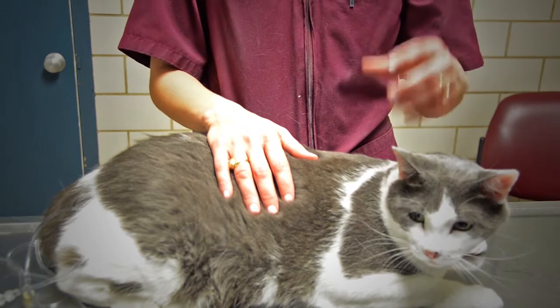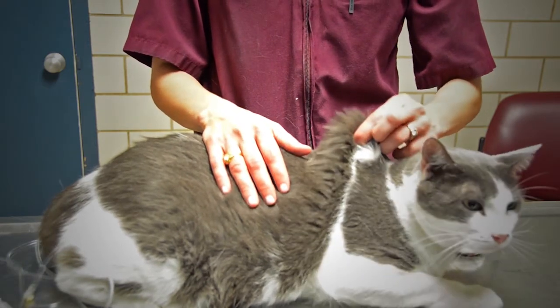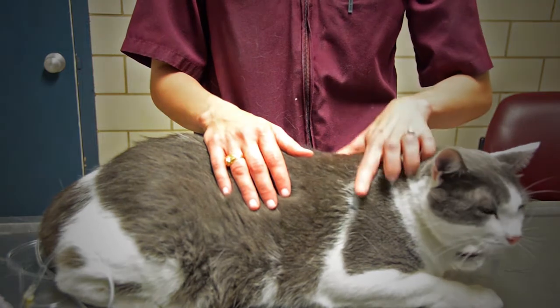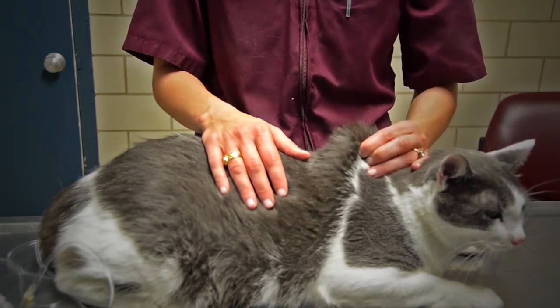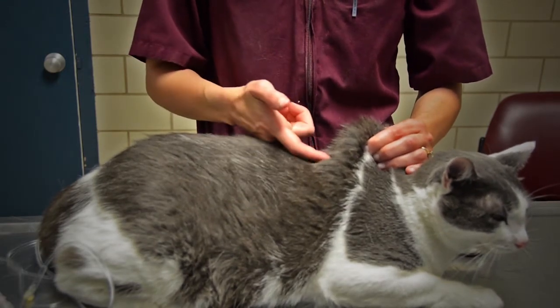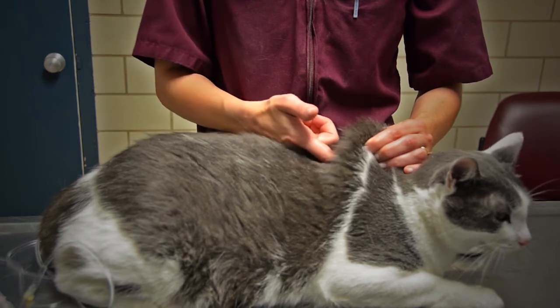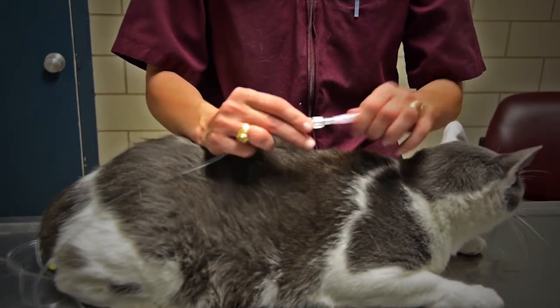You want to use a different area each time, so you don't want one particular area to become overly sore. The next thing you'll do is gently pinch the skin and create a tent. You see my fingers, I'm not getting a huge amount of skin. I'm getting a little bit of skin, and I'm pulling that skin up. That's the great thing about animals. They have all this scruff. So I'm going to create his tent, and I can actually feel where I'm going to place the needle with my finger.